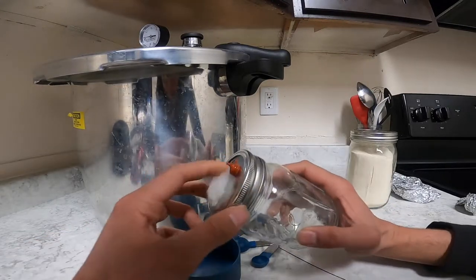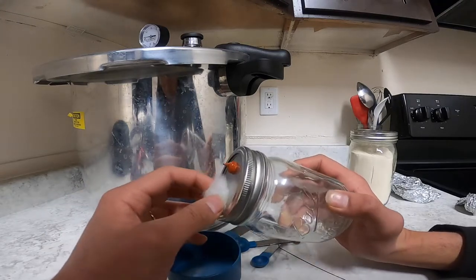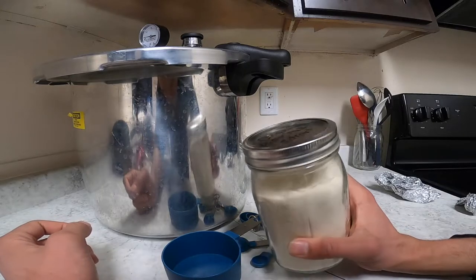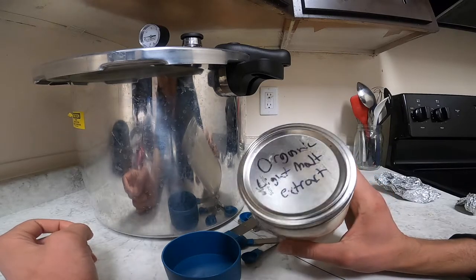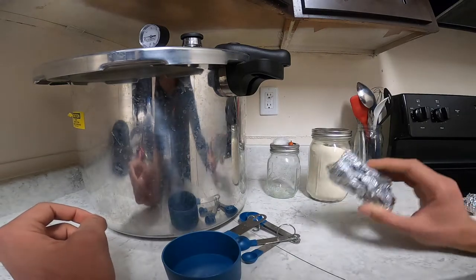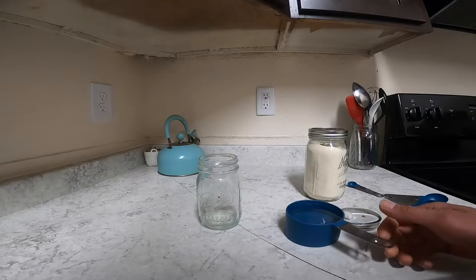Here we have a filter jar with an injection port — I have another video where I show you how to make these, it's very simple. And here I have my organic light malt extract; this is my grain-based sugar and I'm going to be mixing it with water to make the liquid culture. There are a lot of other things you can use like honey or other sugars, but in my experience this works great. I also have some tinfoil that I'm going to put on top of the filter jar when I'm sterilizing it.